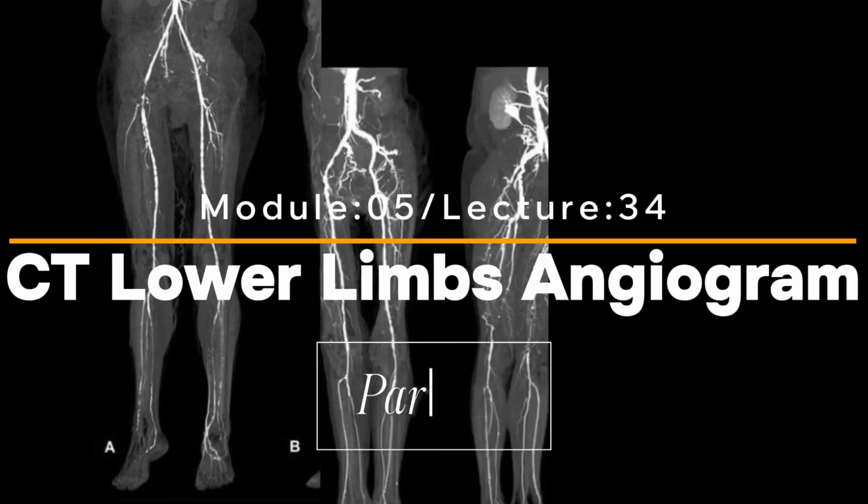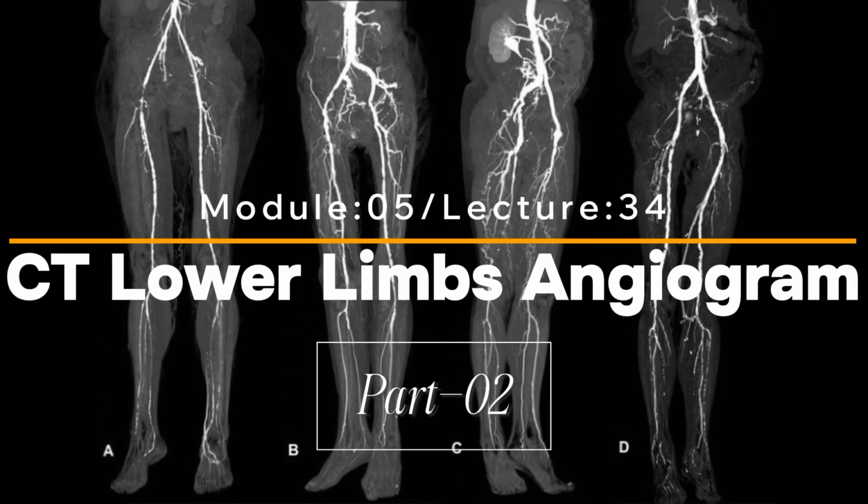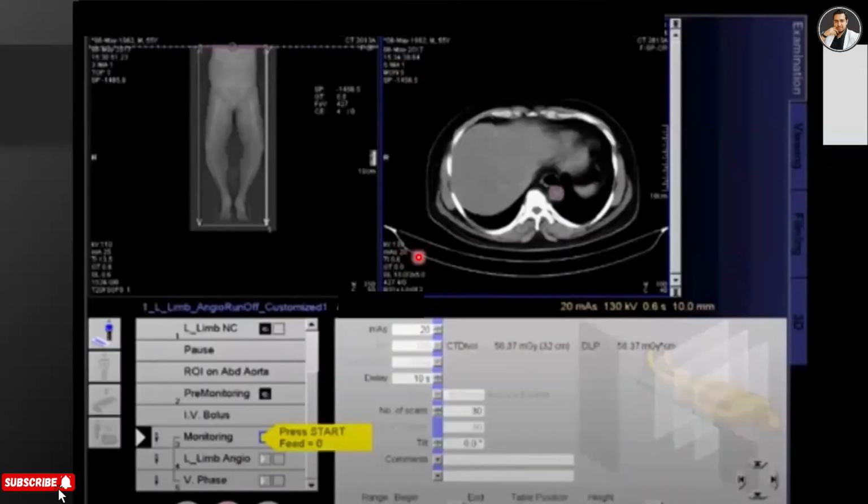So here we have the real monitoring screen. And here we see that the monitoring sequence is ready. Now we will press the monitoring button. Press Start.